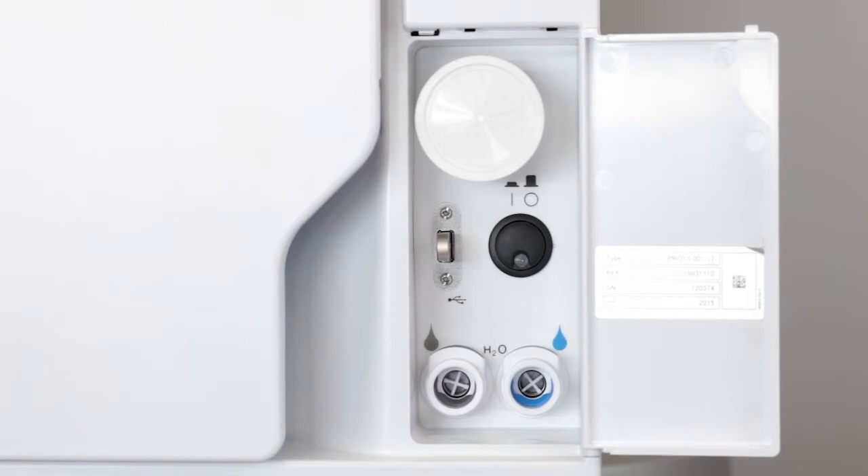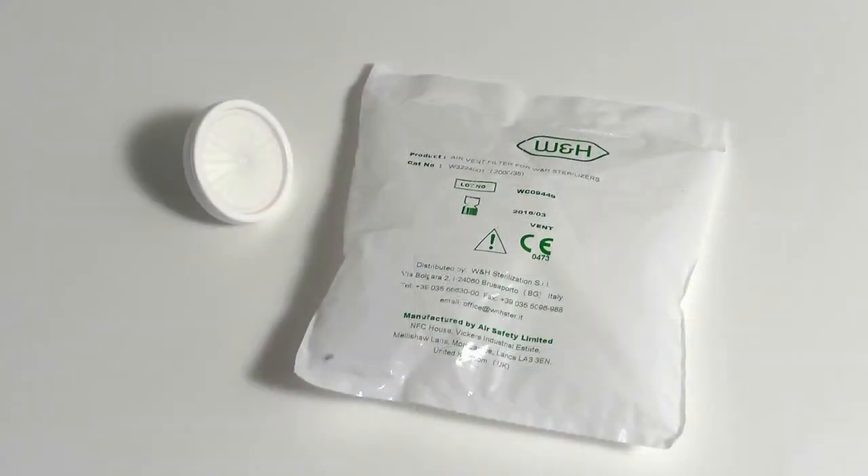Use original W&H products only. This will ensure that your Lisa sterilizer works correctly and ensures that your warranty remains valid.